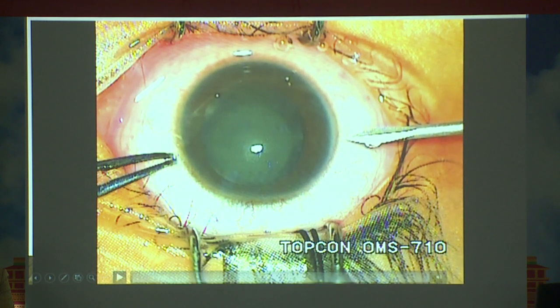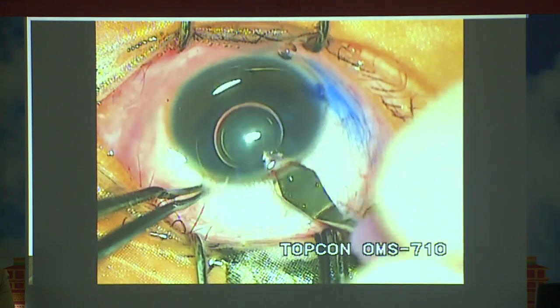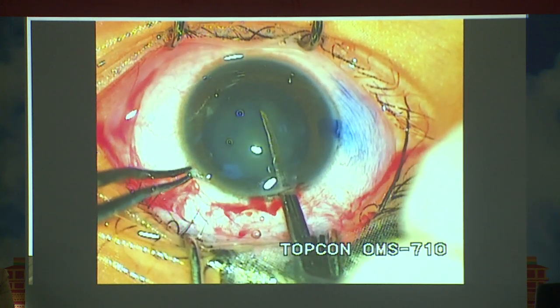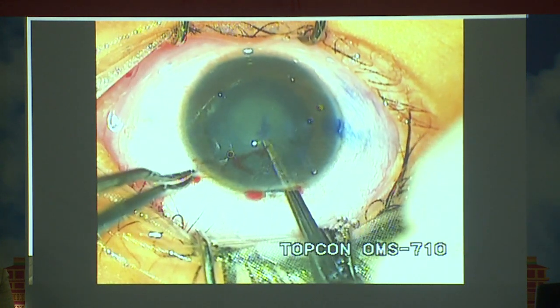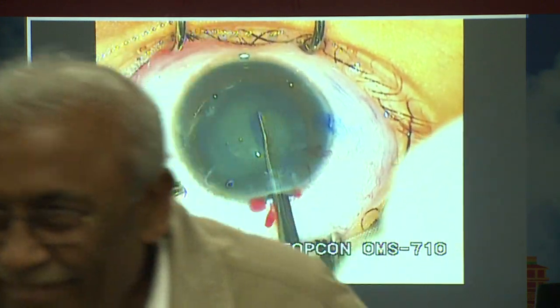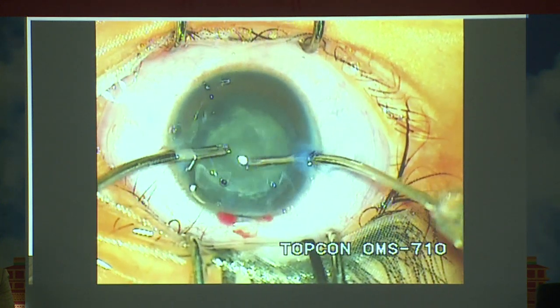This is a 7-year-old boy who presented to us with bilateral lamellar cataract. We went ahead to do a side port incision. You have to always stain the capsule, not only for visibility, but it makes the capsule soft and gives you a controlled manner. Always use Utrata forceps or micro scissors and a grasper. Put high viscoelastic so that you get an adequate rhexis, which is very important. If you lose the rhexis, then you lose most of your pediatric cataract surgery.